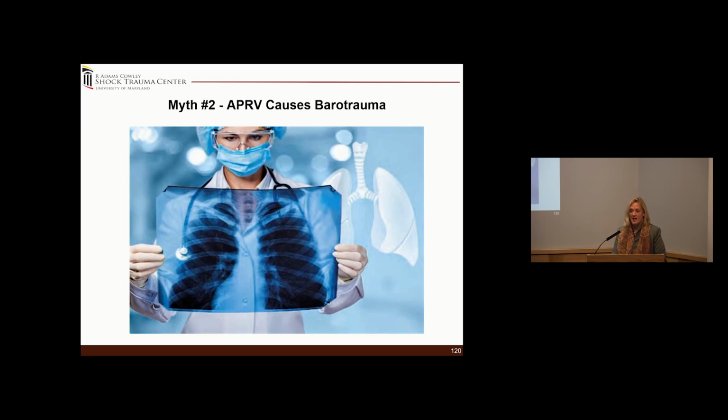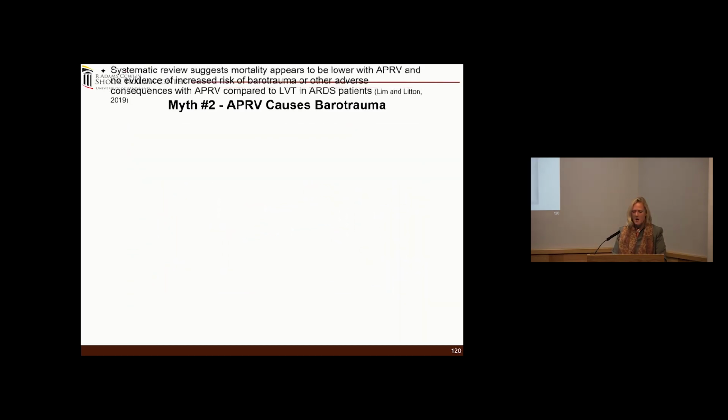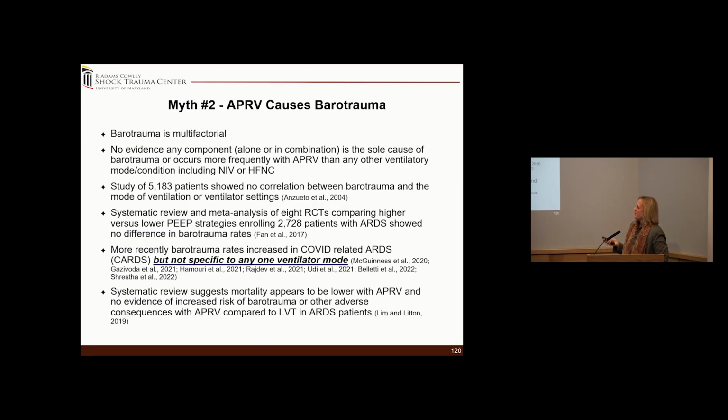We hear this a lot. APRV causes barotrauma, and it is not questioned. It is emphatic. It does cause barotrauma. But here's the problem with that. Barotrauma is multifactorial, and in fact, there's no evidence that any component alone or in combination is the sole cause of barotrauma. And this means that compared to any other mode, invasive or non-invasive, they actually looked at a study of 5,183 patients, and there was no correlation between barotrauma and the mode or any setting.